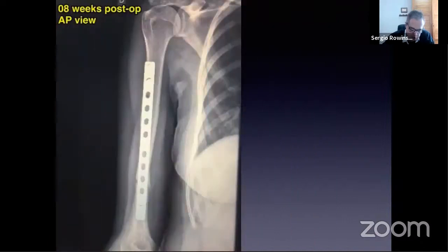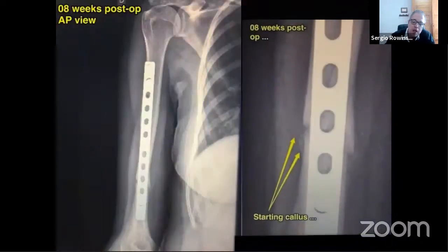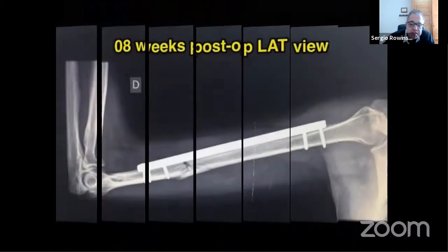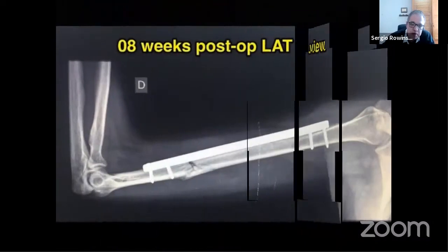This is 8 weeks post-op. What I've been learning is that radiographical callus appears around 10 to 11 weeks, but as long as the patient is doing fine clinically, everything is absolutely okay. Clinical healing precedes the radiographical healing. This is the mantra of this technique. This is 8 weeks post-op, a beautiful callus.